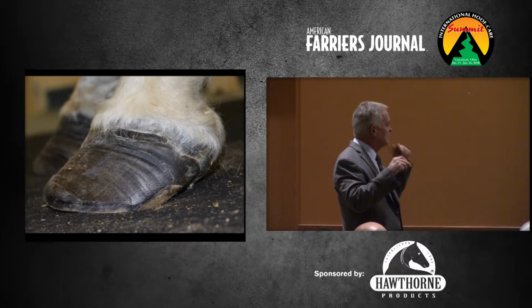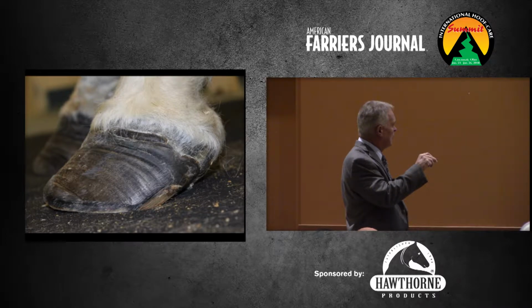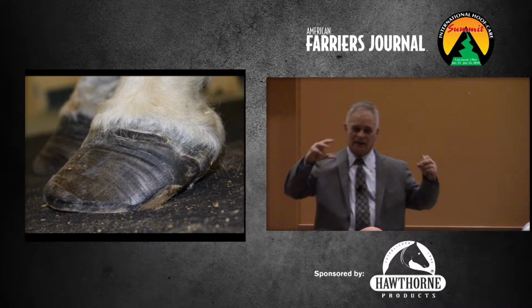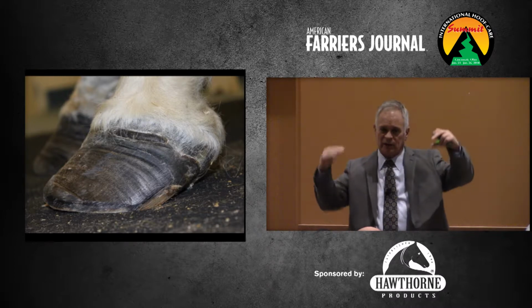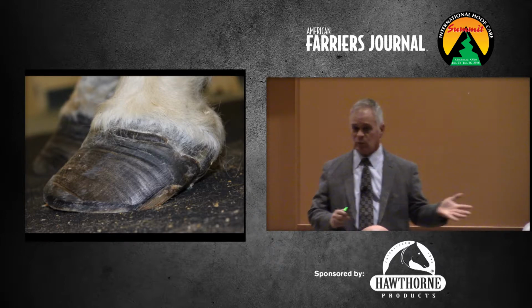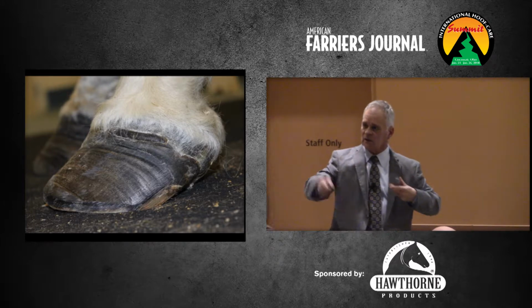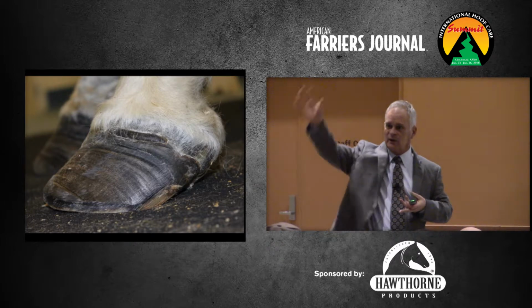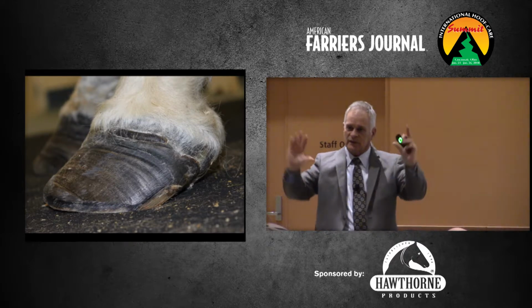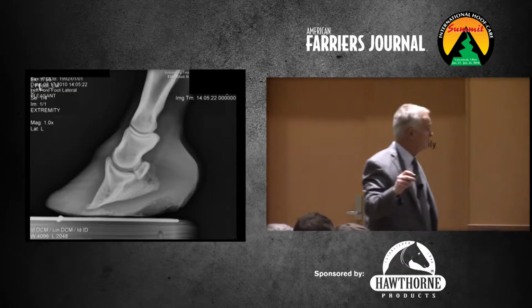Yeah, so the comment was just evaluating the growth rings. Again, we would all imagine this ring came out of the coronet about the same time, and they're jamming, crunching in the toe, and it's growing what we'd call normal at the heel and abnormally at the toe. That's how, you've all seen the old founder pony that curls up, and everybody thinks it's their toe that's just taken off, and it's not. It's just getting crunched and pushed up as a result of that abnormal growth, heel relative to toe is probably the best way to put it.